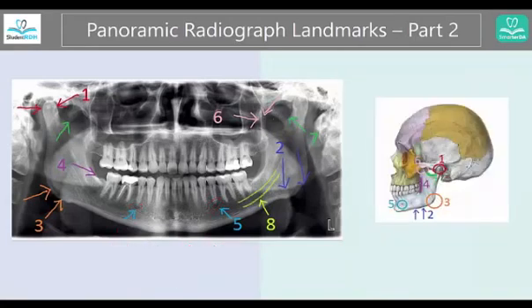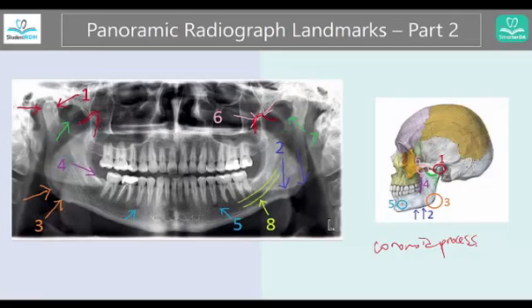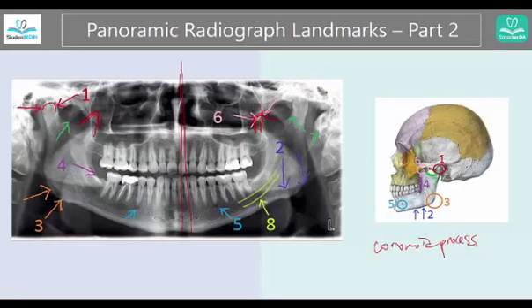Number six is this area — it's a little difficult to see. This is the coronoid process, not to be confused with the condyle we already talked about. This is again towards the midline. One way to see it is to locate the condyle and go a little below and towards the midline to find it. Another good answer for the number six area would also be the lateral border of the maxillary sinus.